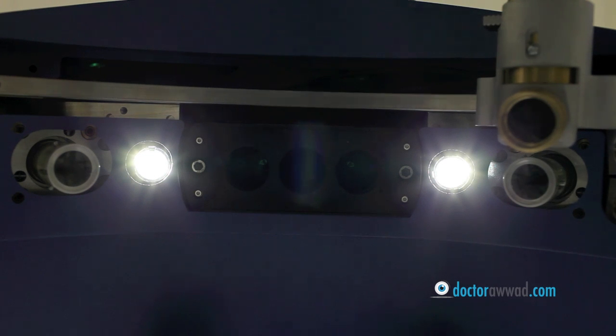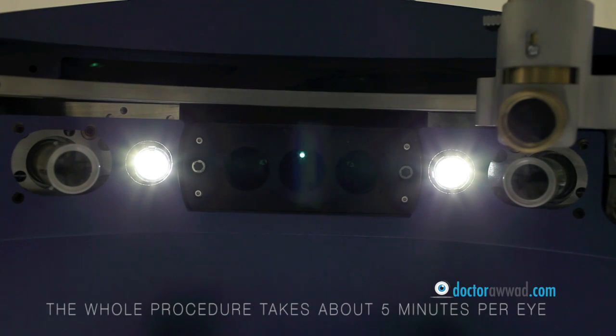Once you look at the light again, the laser will continue exactly where it left off. Looking at the light, however, will ensure uninterrupted, smoother treatment. The whole procedure will take around 5 minutes per eye.